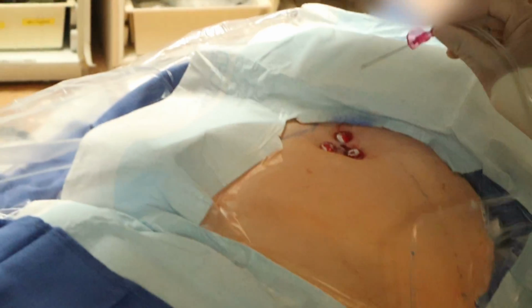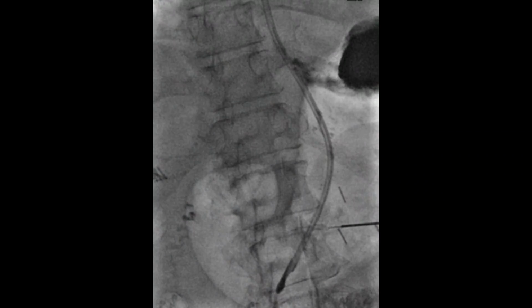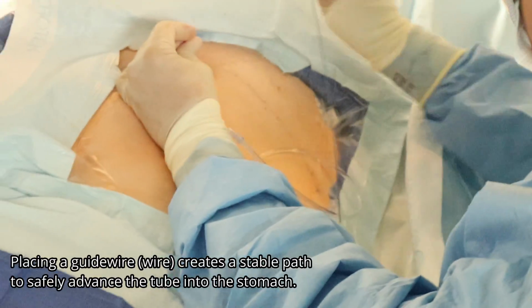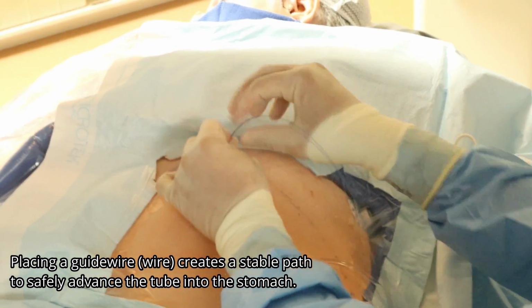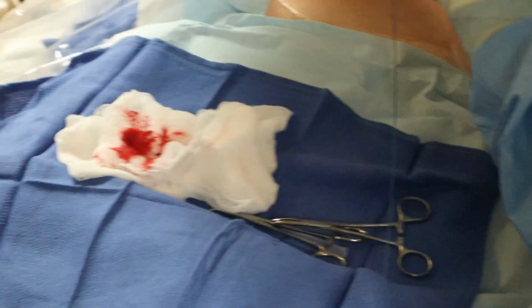Alright, you can go back to RAO 20. Okay, so it's the same thing, straight down into the stomach, like that. Aspirate air back. Inject contrast. We'll save that one. Put this wire right through. Wire into the stomach, let the wire kind of pull over the wall of the entry. The wire is now working very well. So we're going to take this needle out over the wire, sharp coming back.